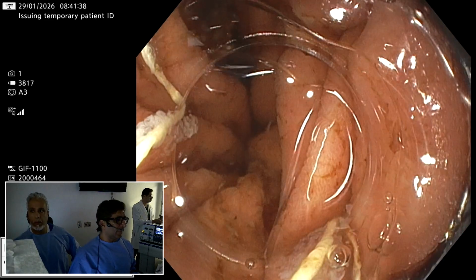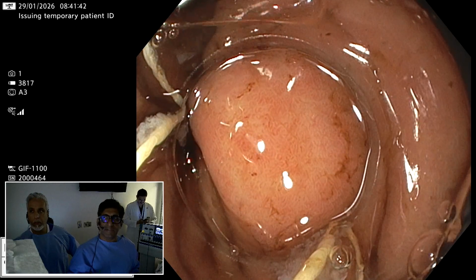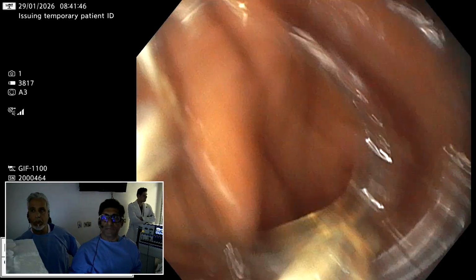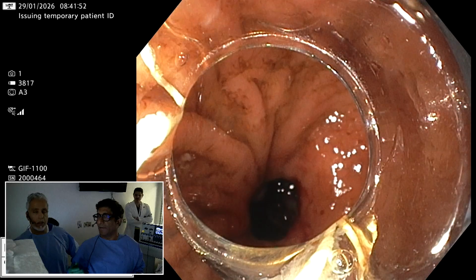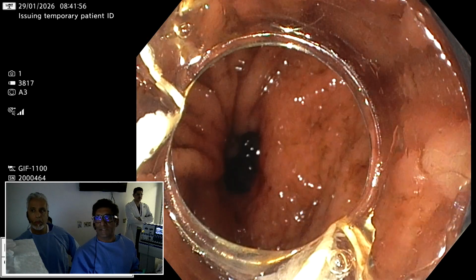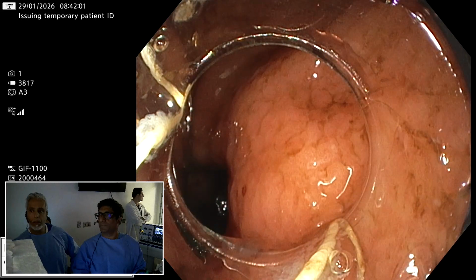Another disadvantage of the FTRD device is that once you apply it, the clip is difficult to remove, and further surveillance becomes difficult. Once there is a big scar with a clip, you cannot do good surveillance. Right, and absolutely, CT and other things will not pick it up. So for these lesions, I think this is also a good option.